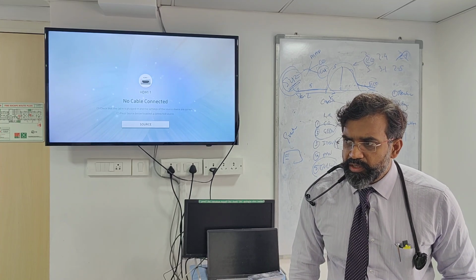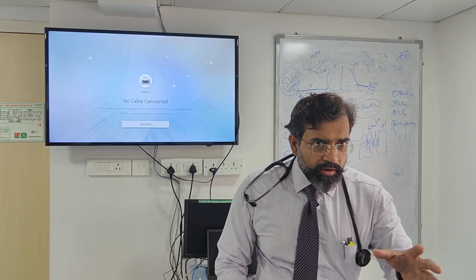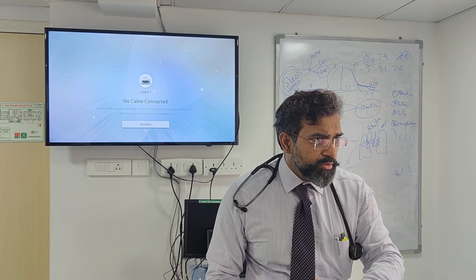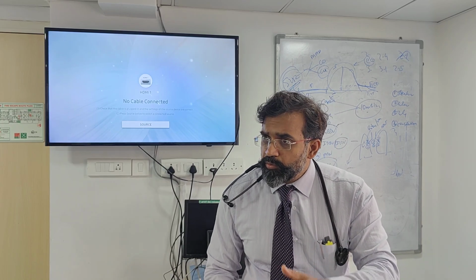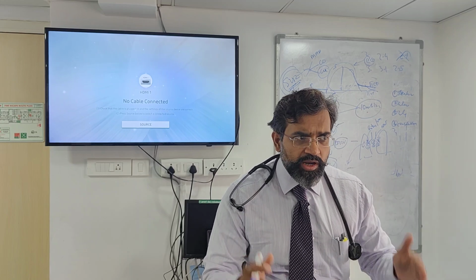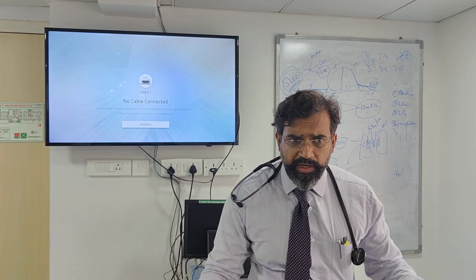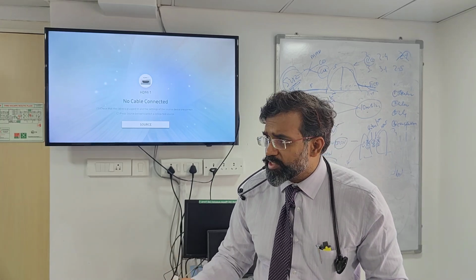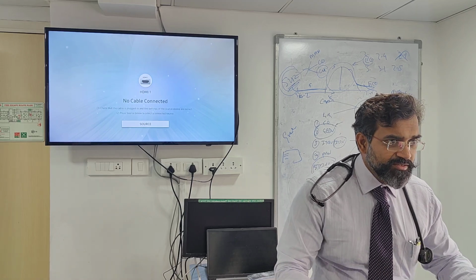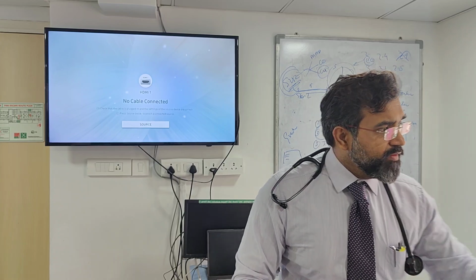Are you understanding? That is if the EVLWI is high. EVLWI is a better marker of prognosis than your lactate also. Okay. What does the body do? Our body tries to keep most of the circulation inside the vascular compartment. We are fighting all through our life to get that water inside our vascular compartment. This is what we are doing, all of us sitting here. Our lymphatics work like that. Everything works like that. So if this starts moving out, it means the patient is very, very diseased. So that's why the marker that is better than even lactate will be EVLWI.